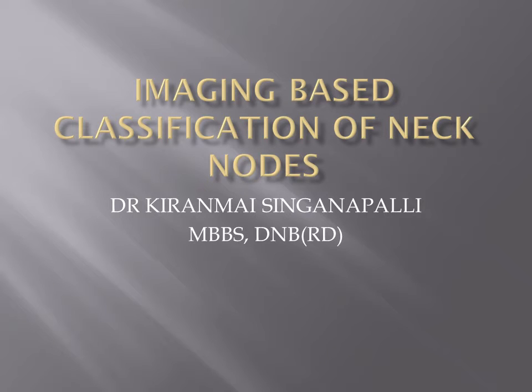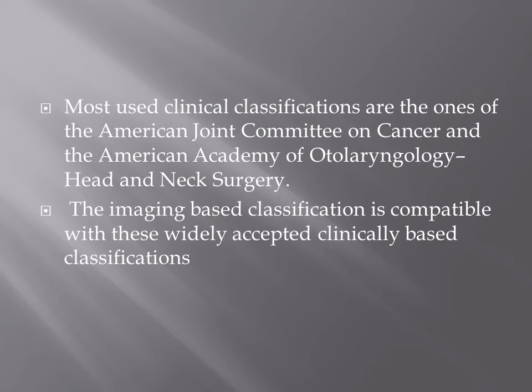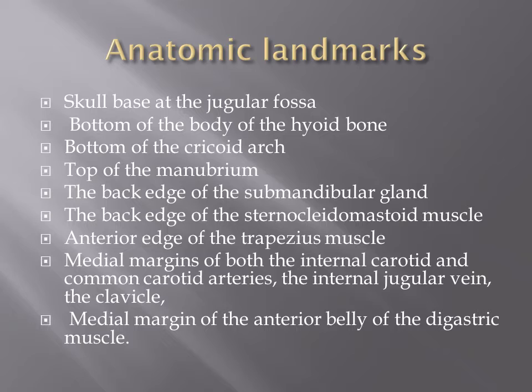For the next 5 to 6 minutes, I'm going to talk about imaging-based classification of neck nodes. Imaging-based classification should be compatible with the currently widely accepted clinical classification so that communication with clinicians will be easy. For classification of neck nodes, we should remember a few bony and soft tissue landmarks.